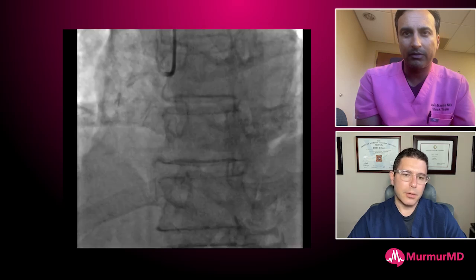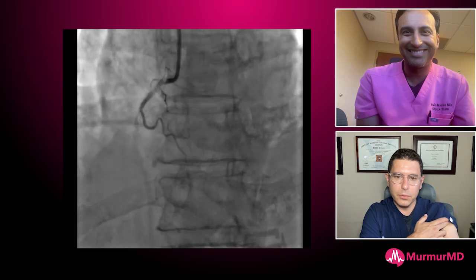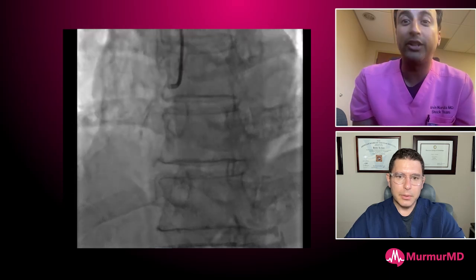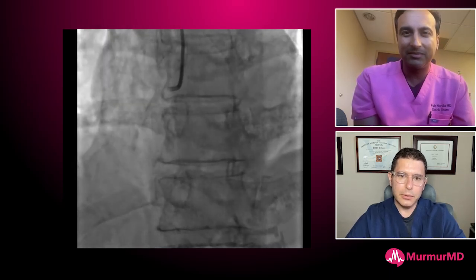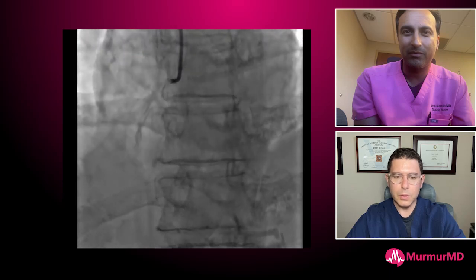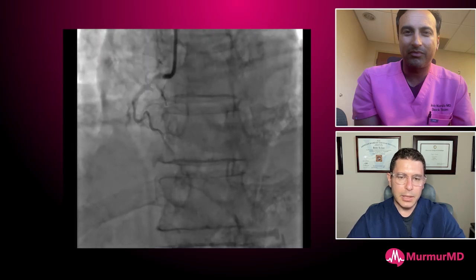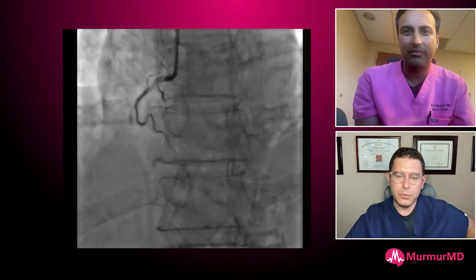This is an iCARi 6 French — I like those in STEMIs with the radial approach. Universal guides aren't very supportive for the left coronary but they're surprisingly supportive for the right, almost as supportive as an AL1 if you really lean on the contralateral sinus. For the left side my go-to is a 6 French EBU 3.75, and for the right I like the 3D right guide.